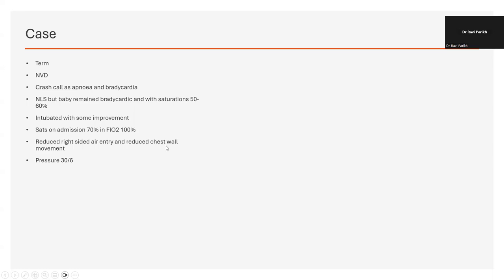Get a cold light done and then get the x-ray and ultrasound. Okay, very good. So he's bradycardic. Cold light is negative. The tube position is good, excellent. So a 3 kilo baby, 9 at the lips, weight plus 6. So then get an ultrasound, and he's bradycardic. It's going to take a little bit of time. What do we think?